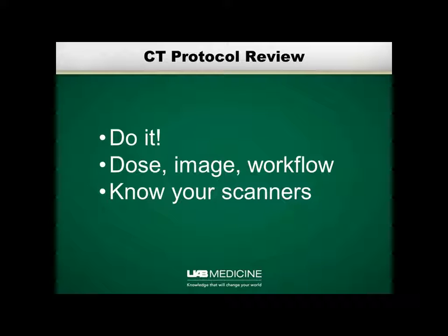as was said earlier, variation in the scanners is the enemy of image quality. It makes your life harder, but you just got to beat down on it. But know your scanners. Validate and then verify. It's not enough to trust.